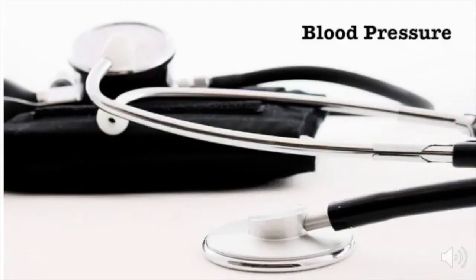Okay, quick recap. We've arrived on scene. We determined the patient is stable. We've checked the LVAD and can hear the hum of the pump. The batteries are working, and we've collected the spare batteries and charger in preparation for transport. So what's next? Even in complex patients, you always need to go back to the basics. Remember, vital signs are vital.